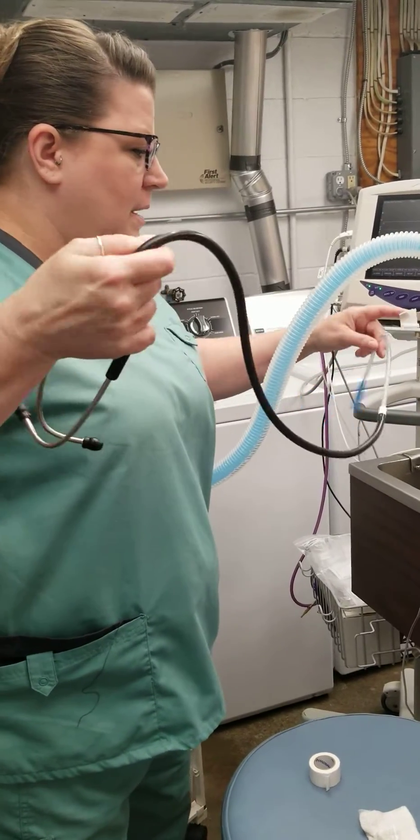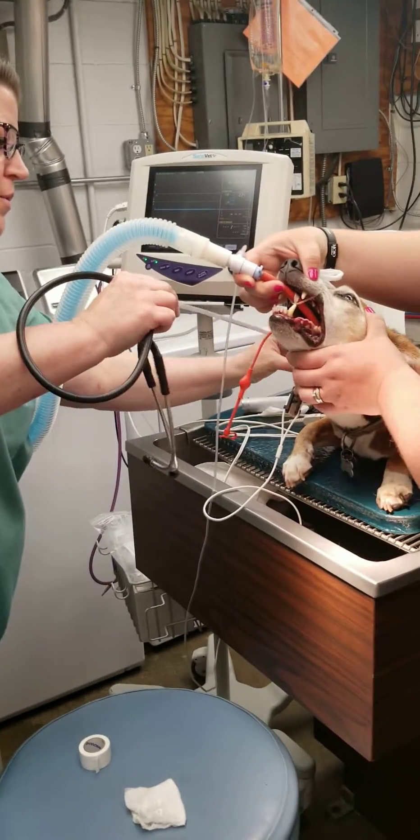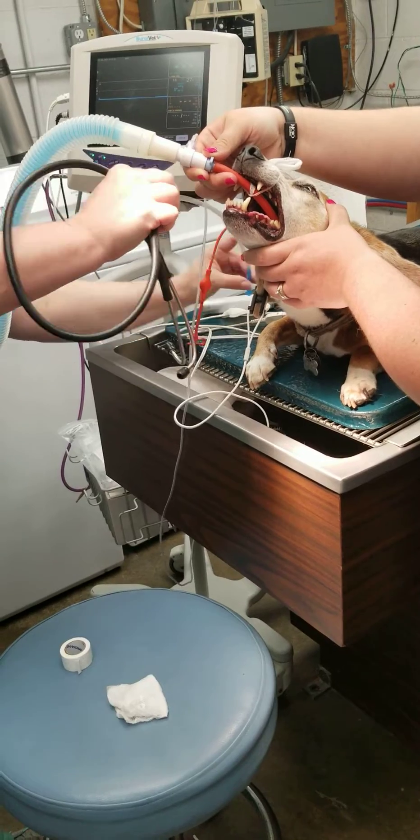I'm going to be demonstrating how to use an esophageal stethoscope. I'm going to measure down to about a fifth rib, right at the level of the heart, and I'm going to mark my tube.